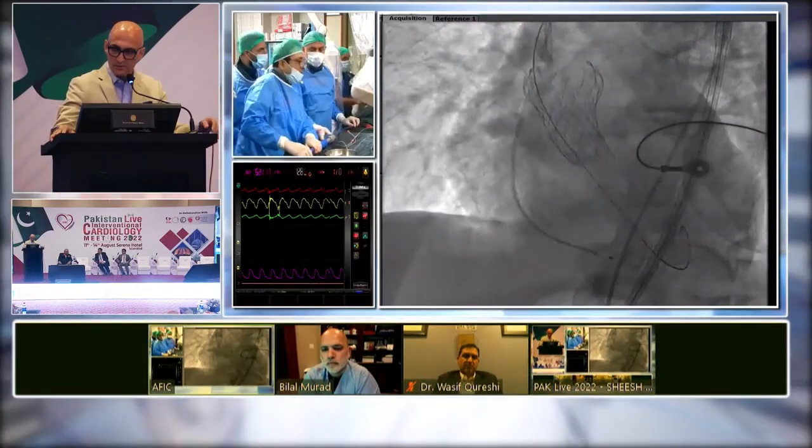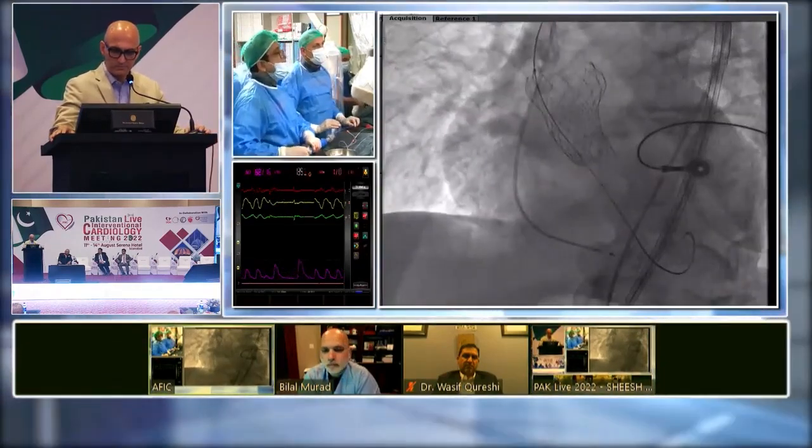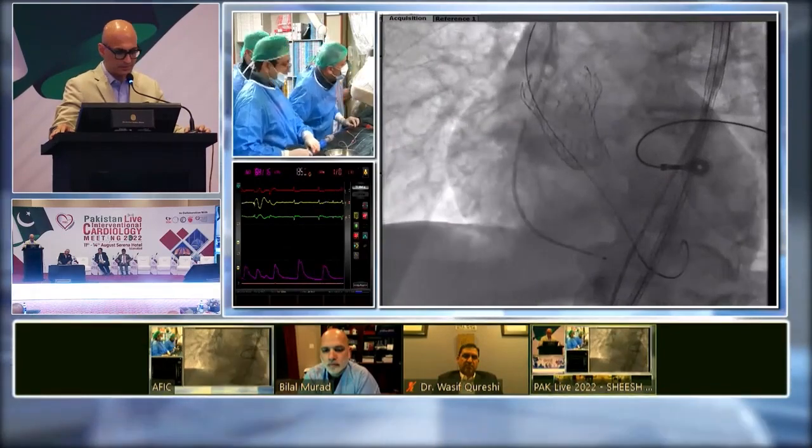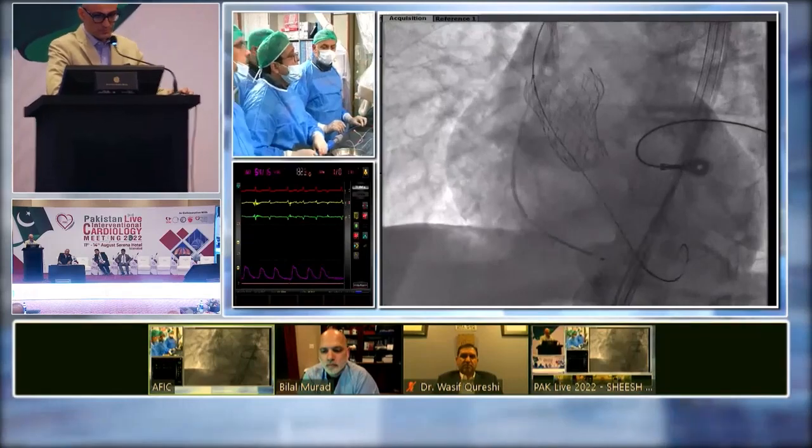Let's have a sheath and balloon ready. 14 French sheath ready, and Omar, the 26 balloon ready. Can I ask you a question, Dr. Tahir? Dr. Omar Goktekin?